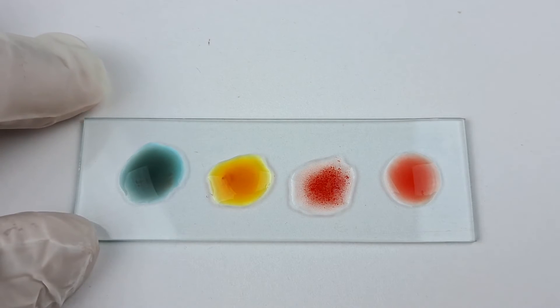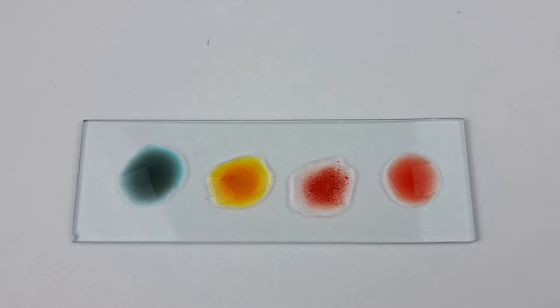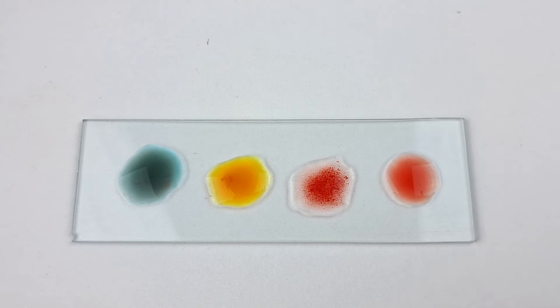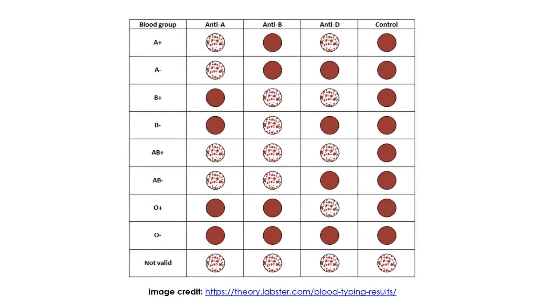The negative control is not expected to show clumping, in which case the experiment needs to be repeated. The blood group of the tested blood sample will now depend on which of the three drops on the slide exhibit RBC clumping. This is a photo collage of the various agglutination patterns that can be seen on the slide for the various ABO and RH blood groups.